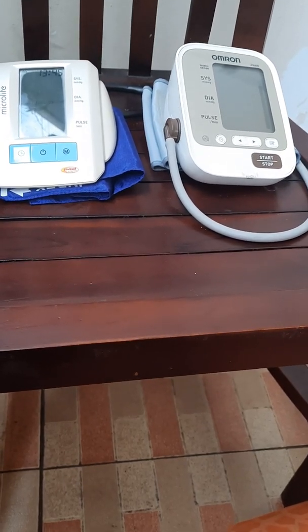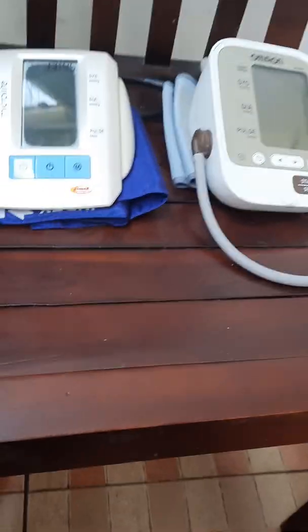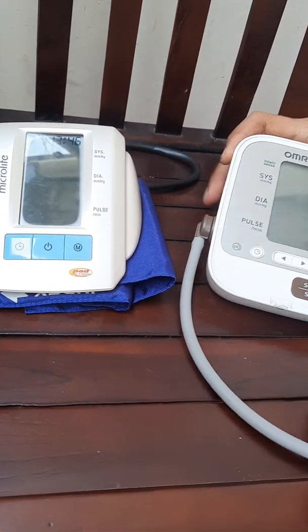Okay, hello, I'm back and this is about the chair we repair. We want to compare blood pressure monitors too. Okay, we try with this one first.